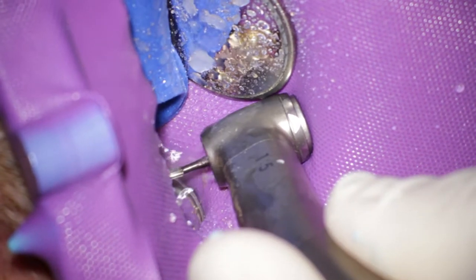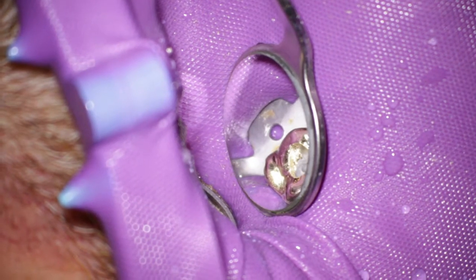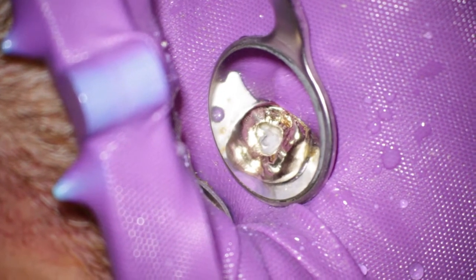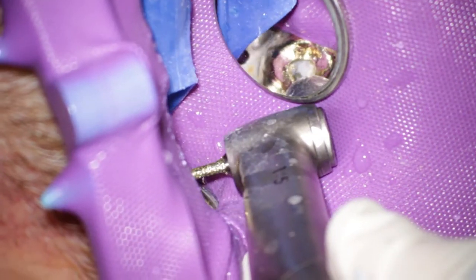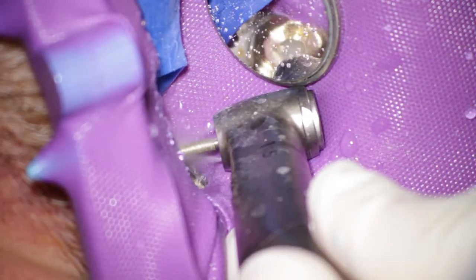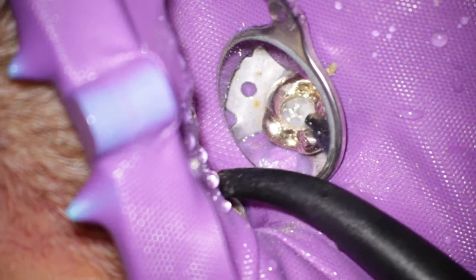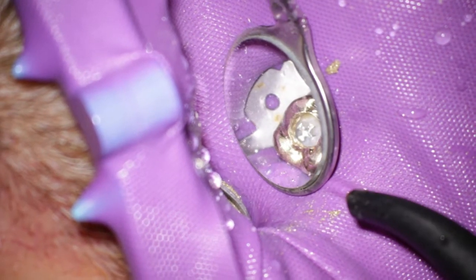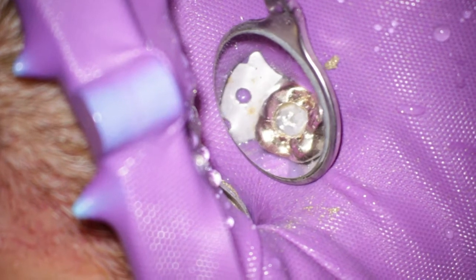If the crown has a leakage, I remove it of course and do a pre-endodontic build-up and a temporary crown instead. It has the advantage that the rubber dam clamps have a better retention, but you will have a different method perhaps. I always try to make the access cavity as small as possible and only extend the access when it is necessary. So you can see I try to drill very conservative into that crown.